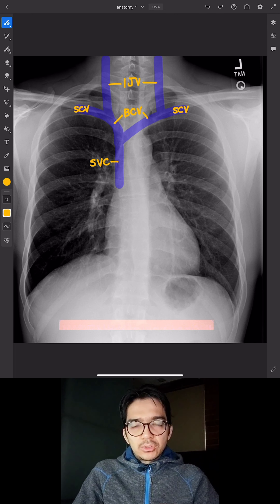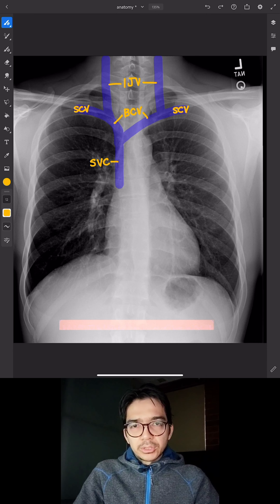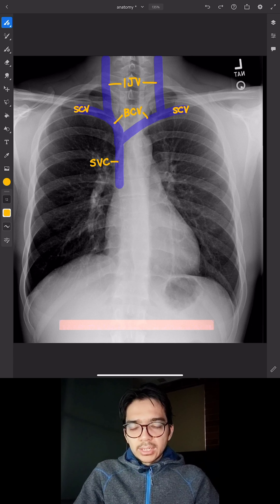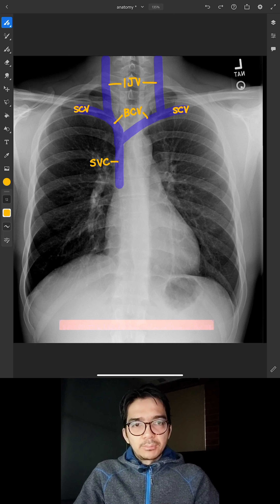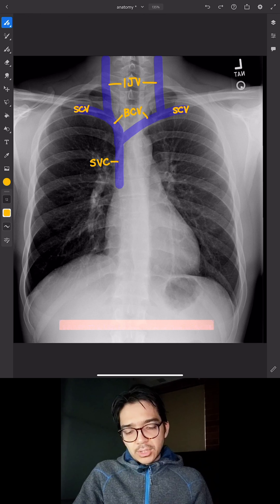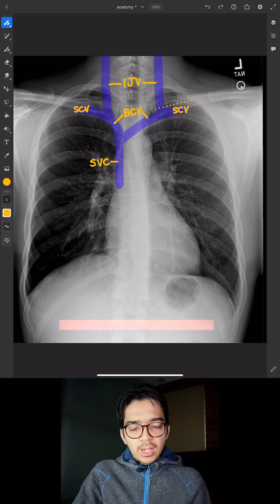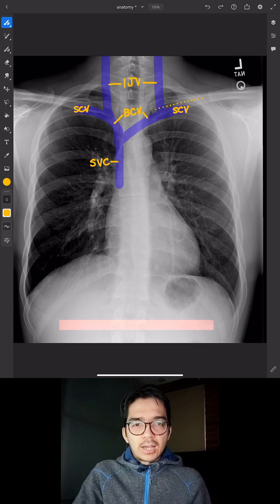When a patient gets a new central line, I generally dictate the side and the vessel that's accessed in order to identify that central line. So I might say there's a new right IJ central line with a tip in the lower SVC. The first important landmark is the clavicles, and notice that the subclavian veins lie just beneath the clavicles.